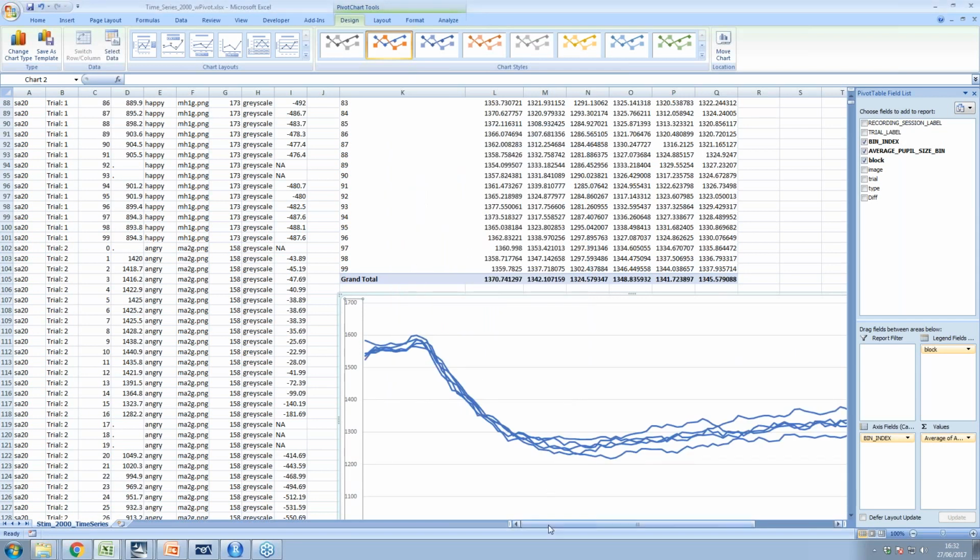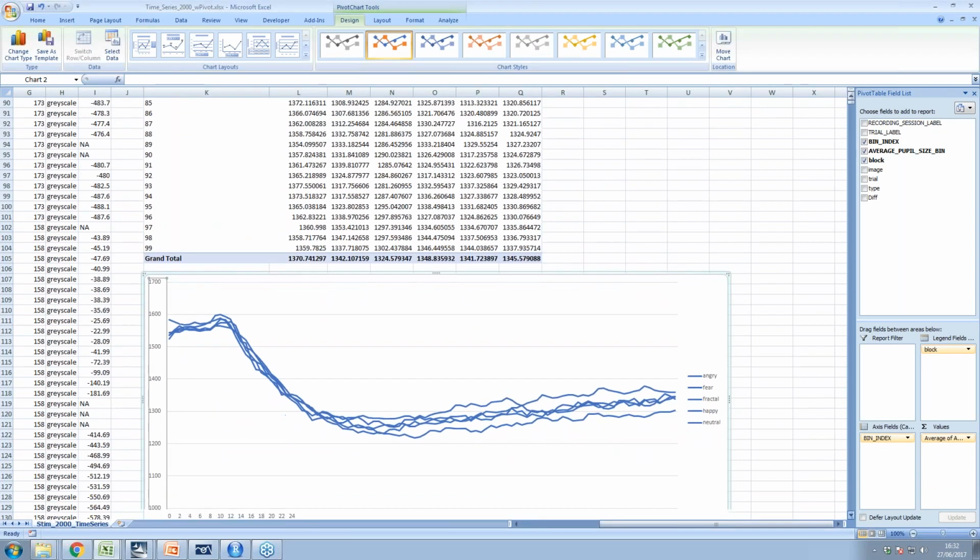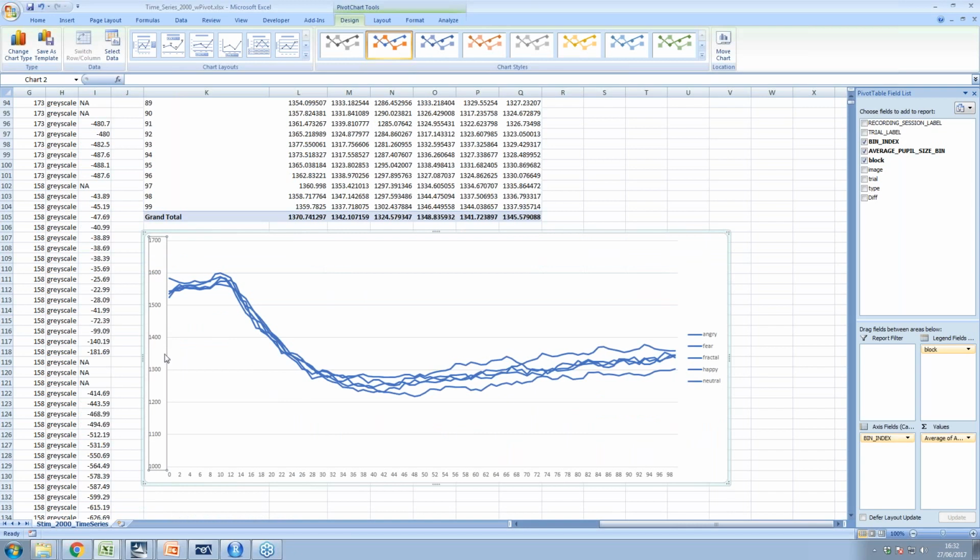And we can see that there's a clear difference. But what you can see most obviously is this. This is when the face or the fractal appears here. There's a delay, about 10 bins, so that's 200 milliseconds, when nothing's really happening. And then you get this luminance response, and it's massive. So there's a huge reduction, constriction in pupil area.